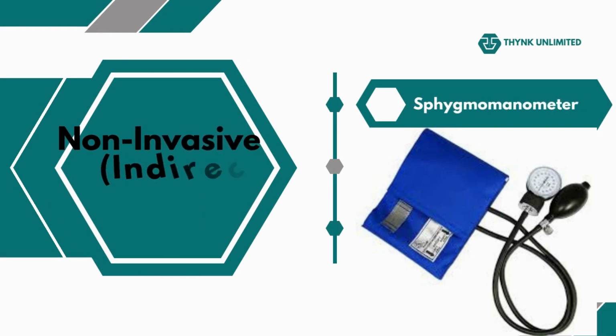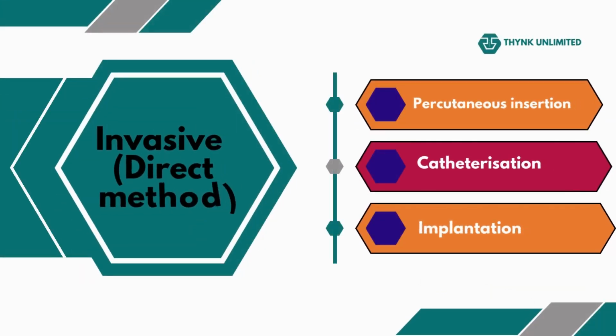Non-invasive methods. Auscultation. This is the traditional method of measuring blood pressure using a stethoscope and a blood pressure cuff. Oscillometry. This method uses a blood pressure cuff and a computer to measure blood pressure. Photoplethysmography. This method uses infrared light and a sensor to measure blood pressure. Different techniques of invasive methods are percutaneous insertion, implantation, and catheterization.